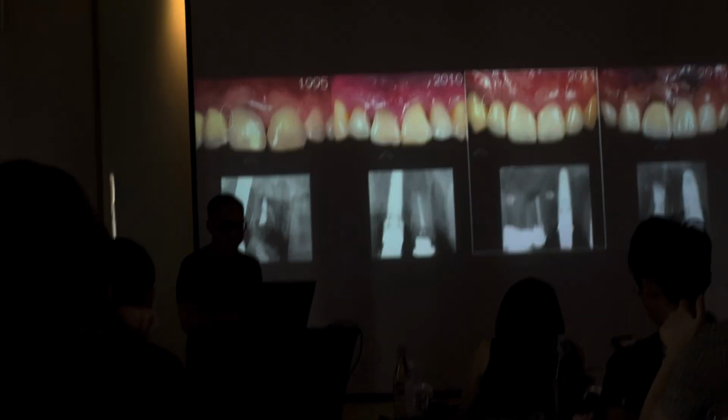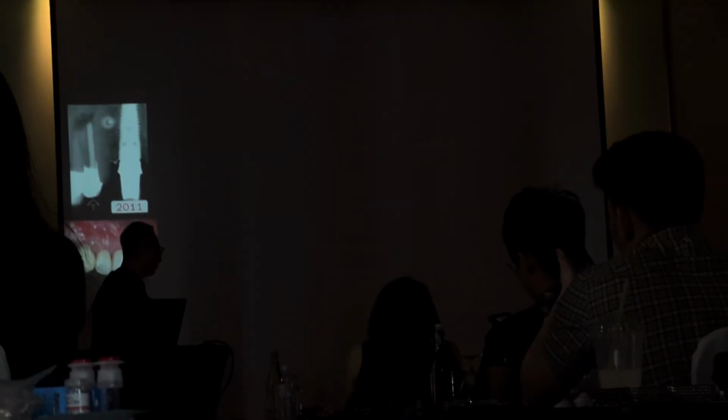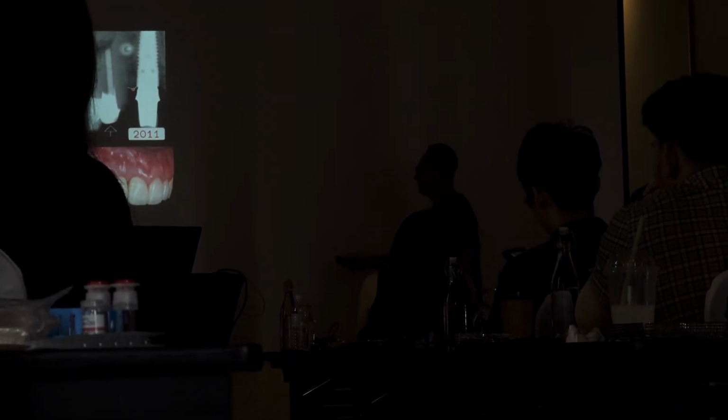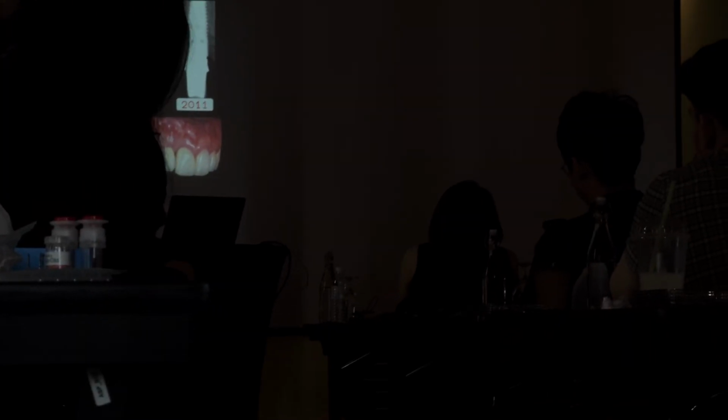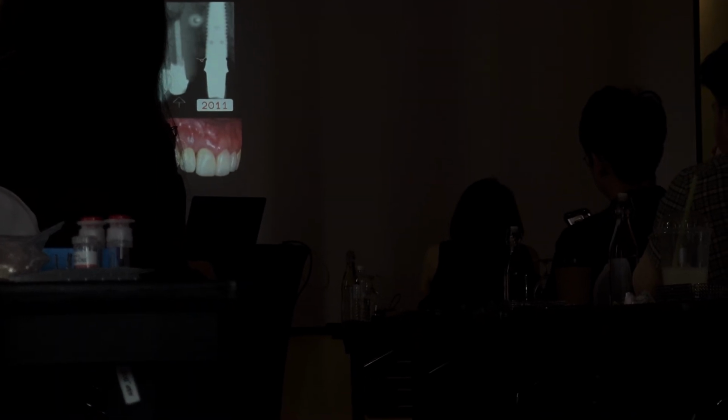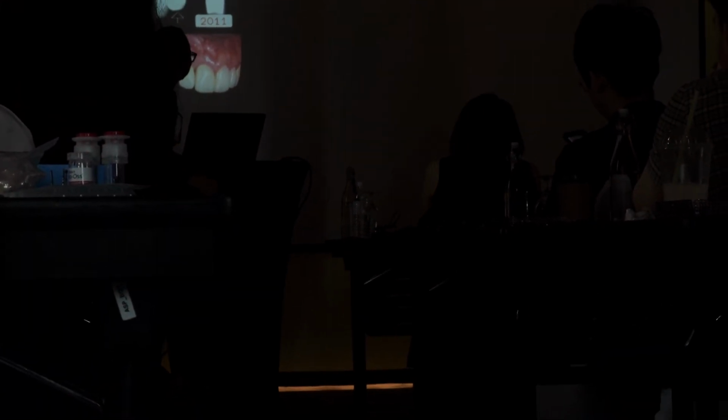Let me just show you this patient here. All right, this patient was referred with a fractured canine, and has a little apical thing here. So for an implant, someone already placed an implant in there. What I decided to do is a root shield. This case I treated back in 2011. I think in my root shield career, this is case number 3. Okay, so I'm very experienced already.